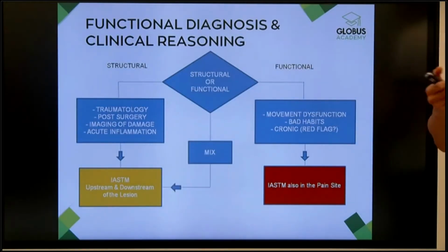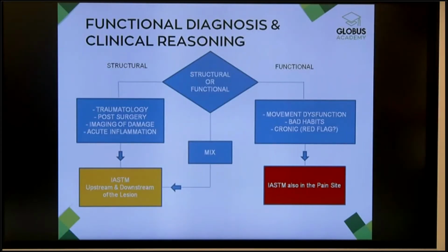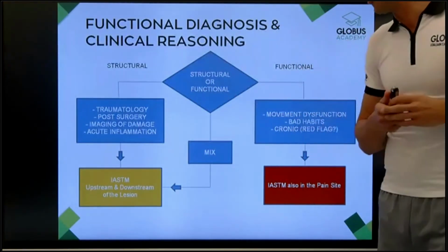Also, we have mixed pathologies, both structural and functional. I suggest you use this kind of approach, not directly on the lesion, but upstream and downstream.